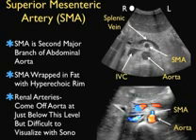Now let's take a look at the ultrasound images to the right, and we see a B-mode or grayscale image towards the upper part of the right side here. Note the spine, and on top of the spine, the inferior vena cava over towards the patient's right, and the aorta towards the patient's left side. We see the classic appearance of the SMA with its bright or hyperechoic rim. Notice that the splenic vein arches on top of the SMA.